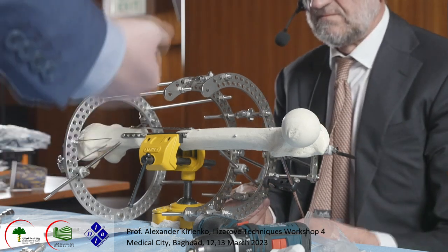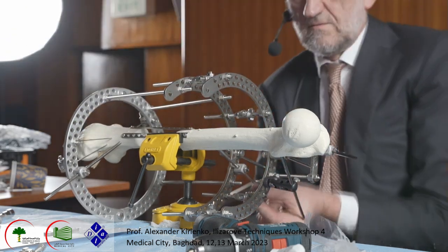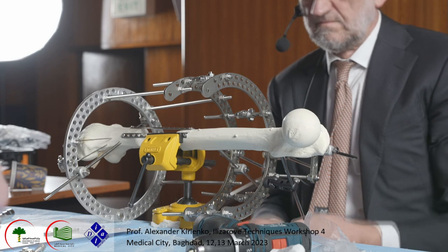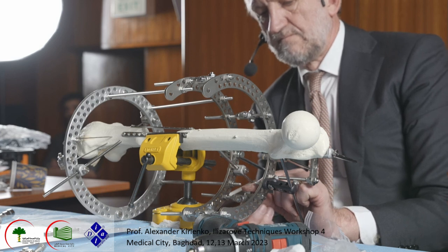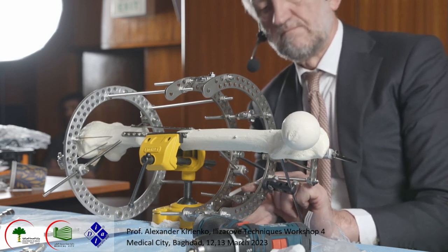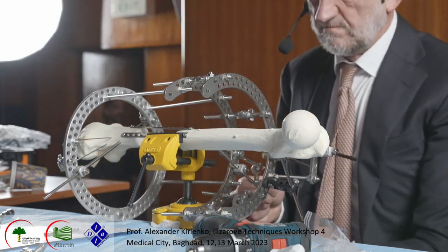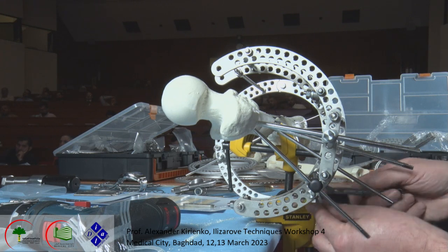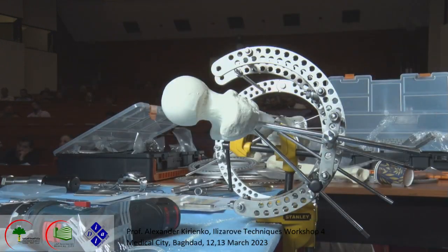Okay. One nut. Okay, this system is much more stable. 4 rods connect them, and this way I show you how we control the lengthening and correct the deformity during lengthening if it's created.